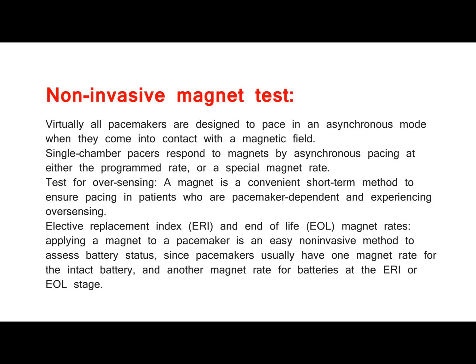Elective replacement index, ERI, and end-of-life, EOL, magnet rates. Applying a magnet to a pacemaker is an easy non-invasive method to assess battery status, since pacemakers usually have one magnet rate for the intact battery, and another magnet rate for batteries at the ERI or EOL stage.